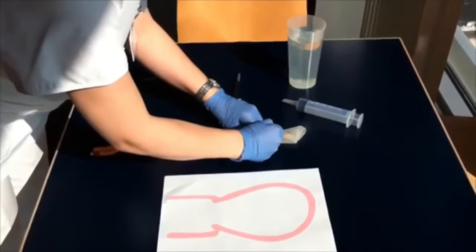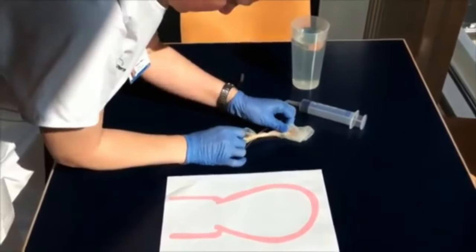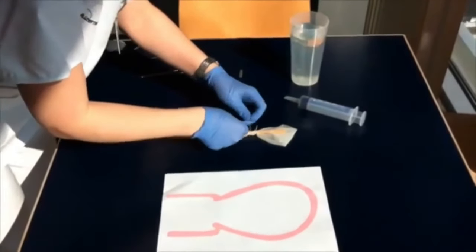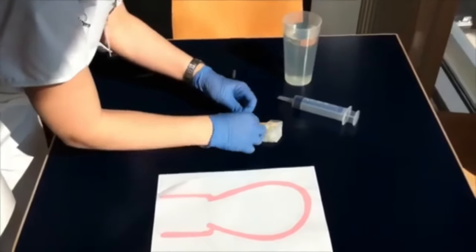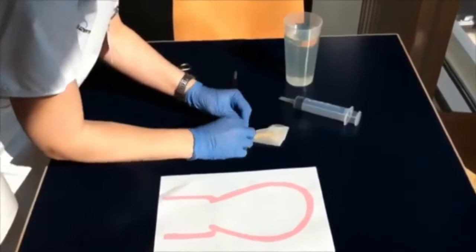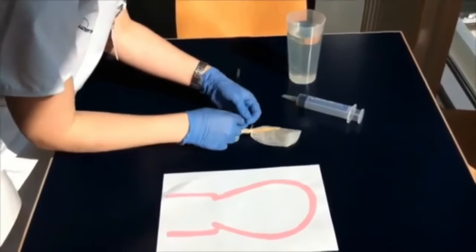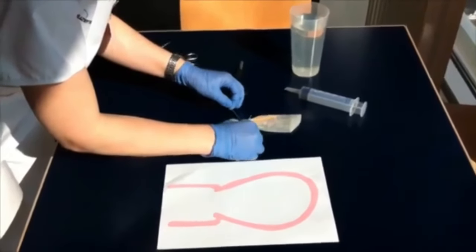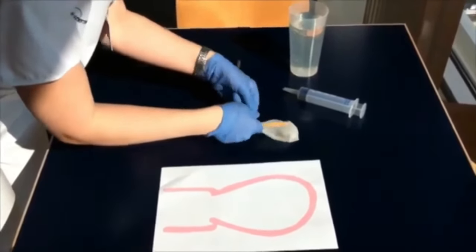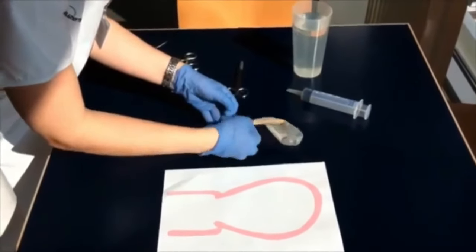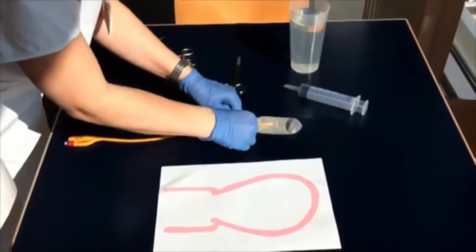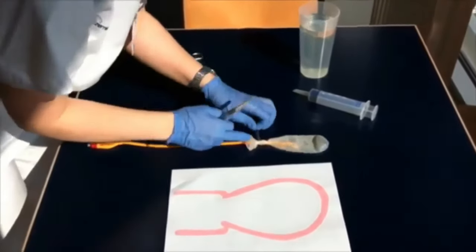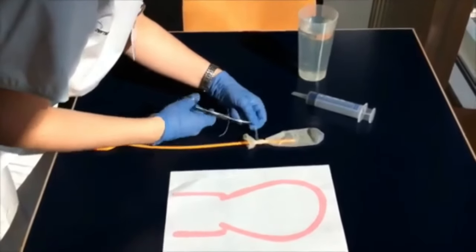This step is very important because we are trying to inflate the condom with around 300 to 500 ml of ringer lactate or normal saline so that a pressure is created inside the uterus. A tamponade is created, and that tamponade pressure presses and compresses over the uterine blood vessels which are bleeding inside the uterus, which cause the postpartum hemorrhage.